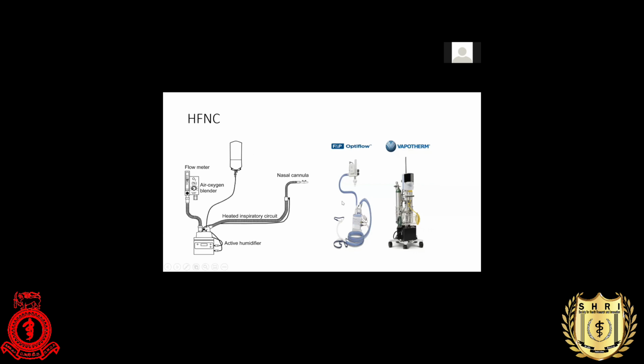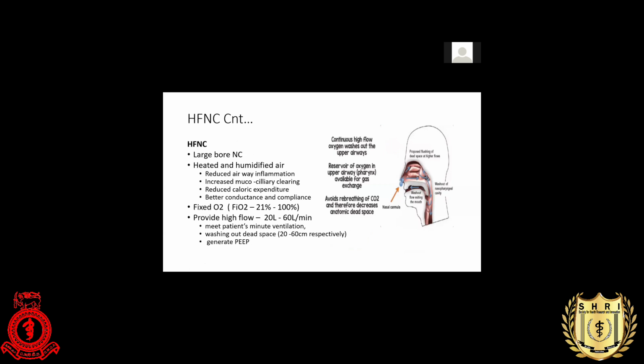Okay, what happens with a high-flow nasal cannula? It has a large bore when compared to the conventional nasal cannula. Because of that, you can give high flow to the patient, and it will supply heated and humidified air. Because of that, it will reduce airway inflammation. If you send cold and dry air, that causes irritation to your nasal passage, and also reduces normal mucociliary function, and ends up with a collection of mucus. So that can be eliminated by using heated and humidified air.